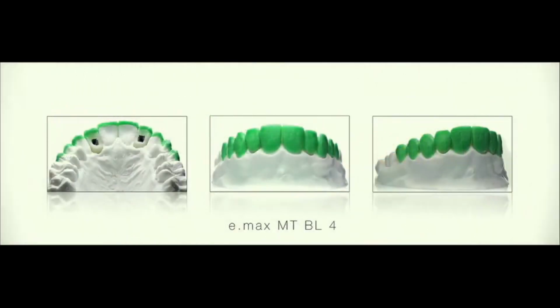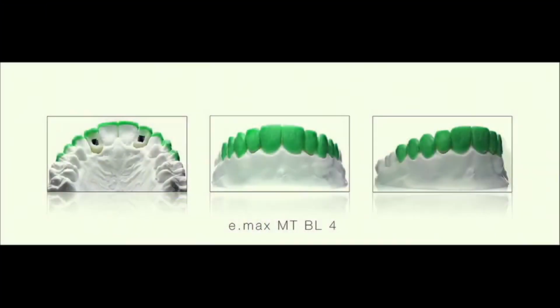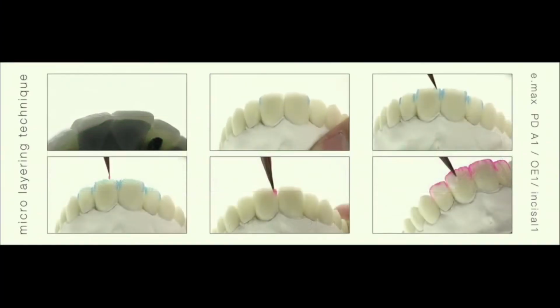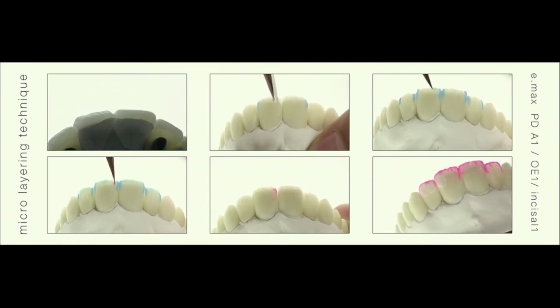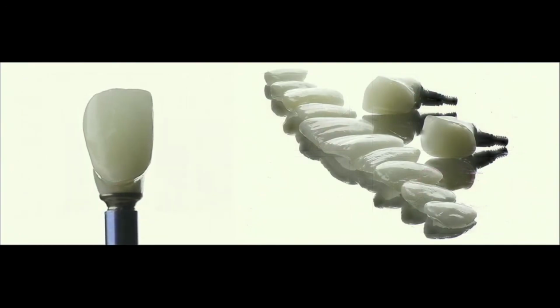So with that token, after I prep the teeth, just like now, converting an implant case into a very simple veneer case, Hilal is doing the final wax-up, which is the same design of the Visage Smile, and using, again, the Emax ingots, but just making an incisal third cutback, doing the micro layering technique. And with that, we're done with the veneers.